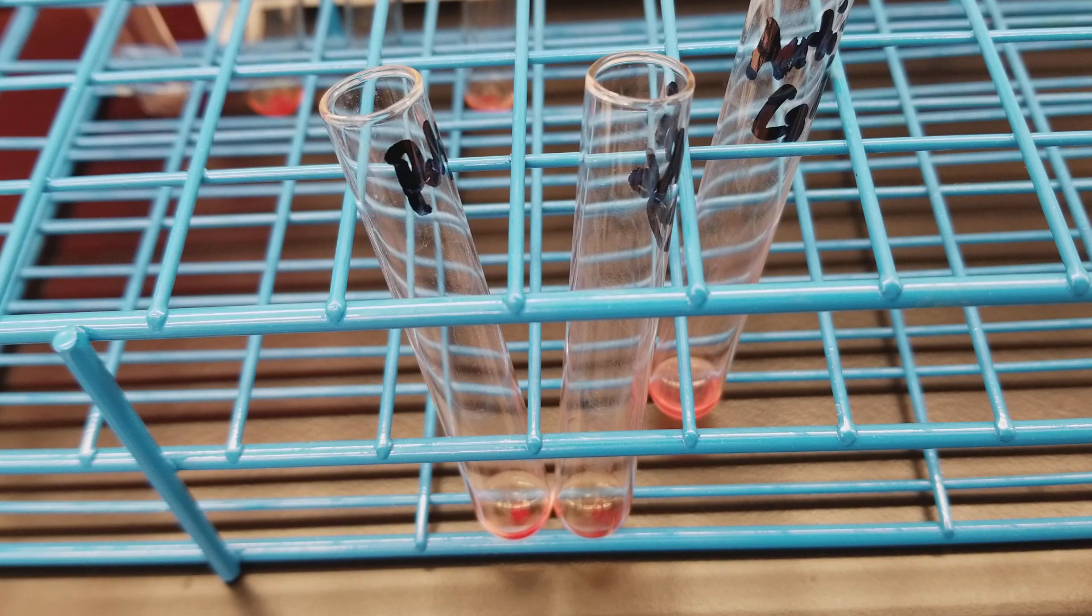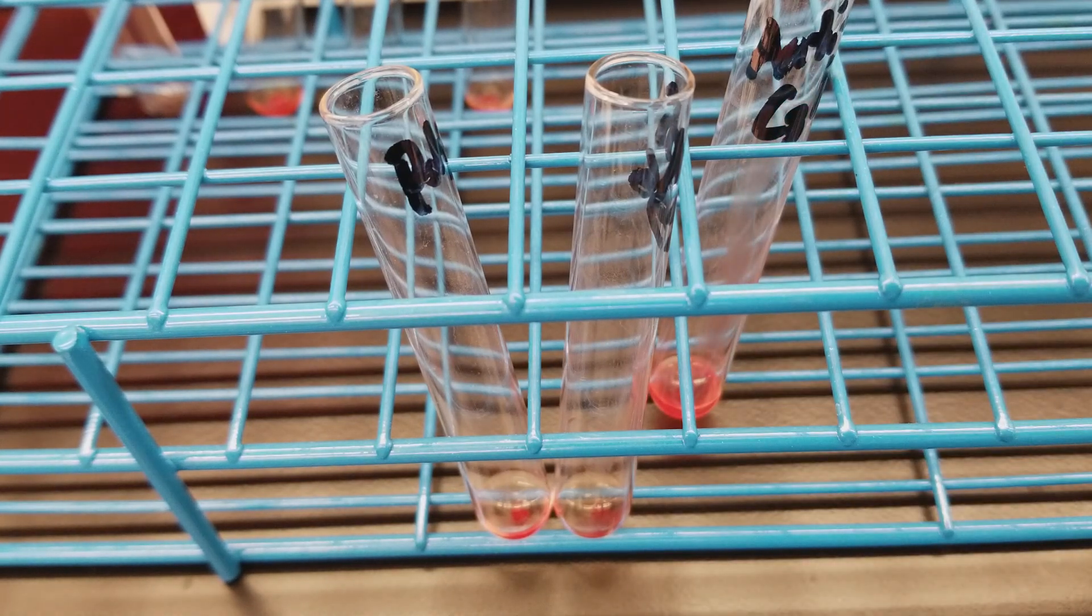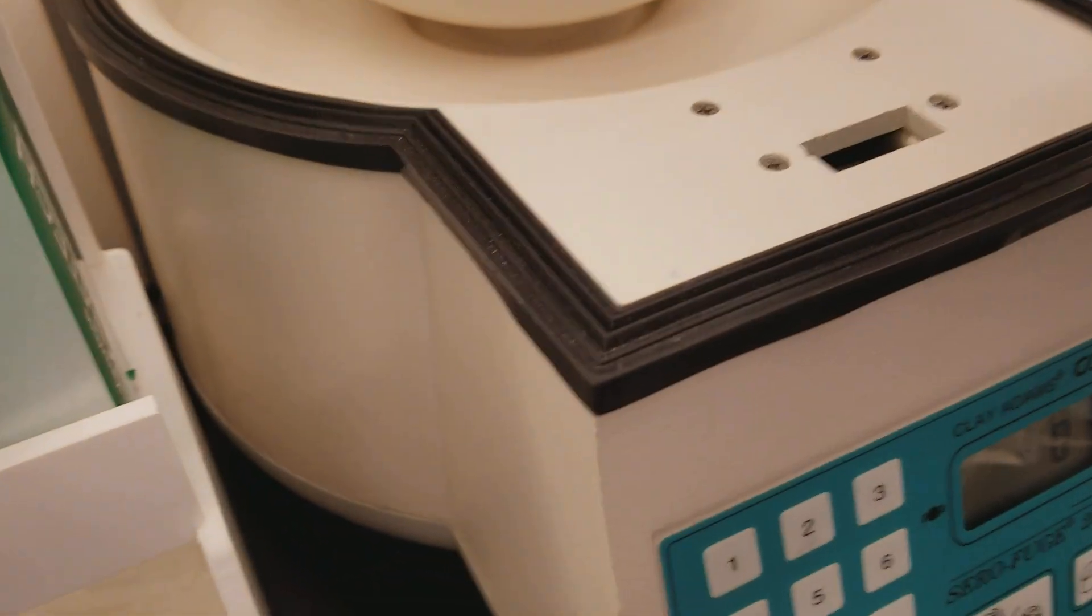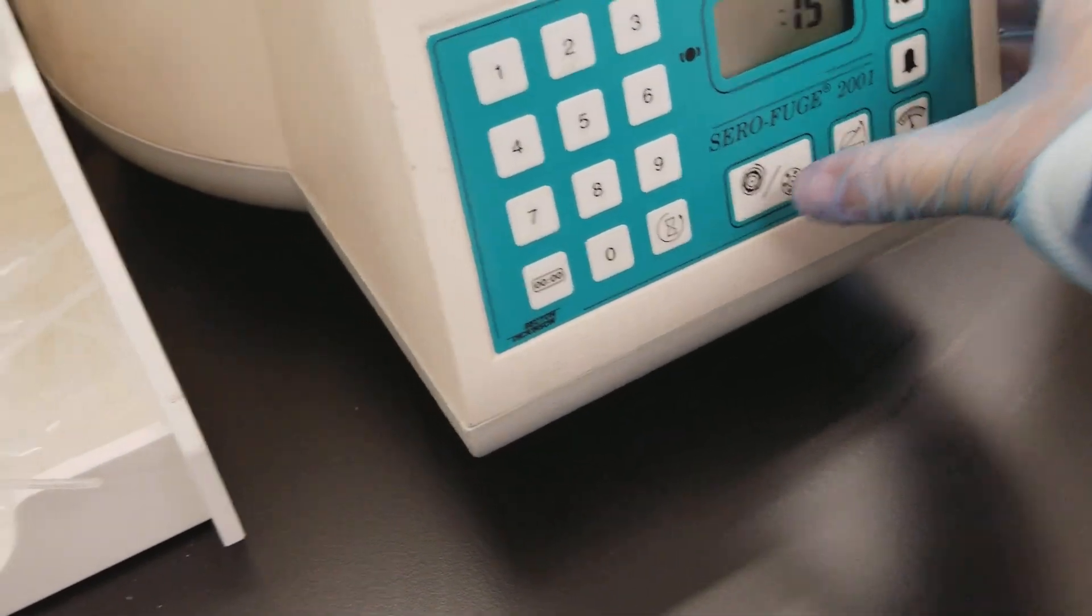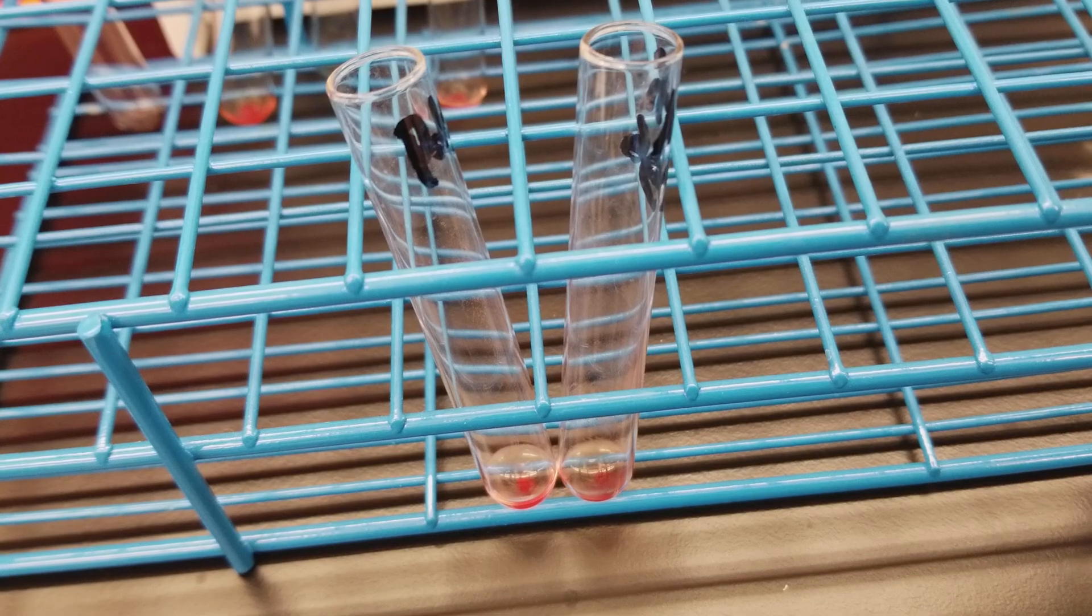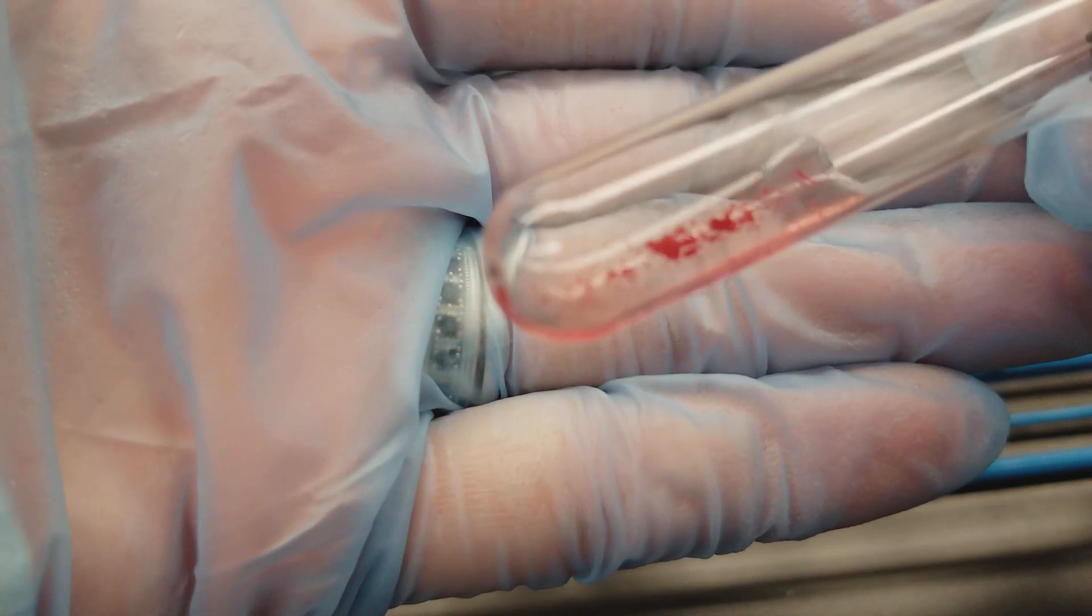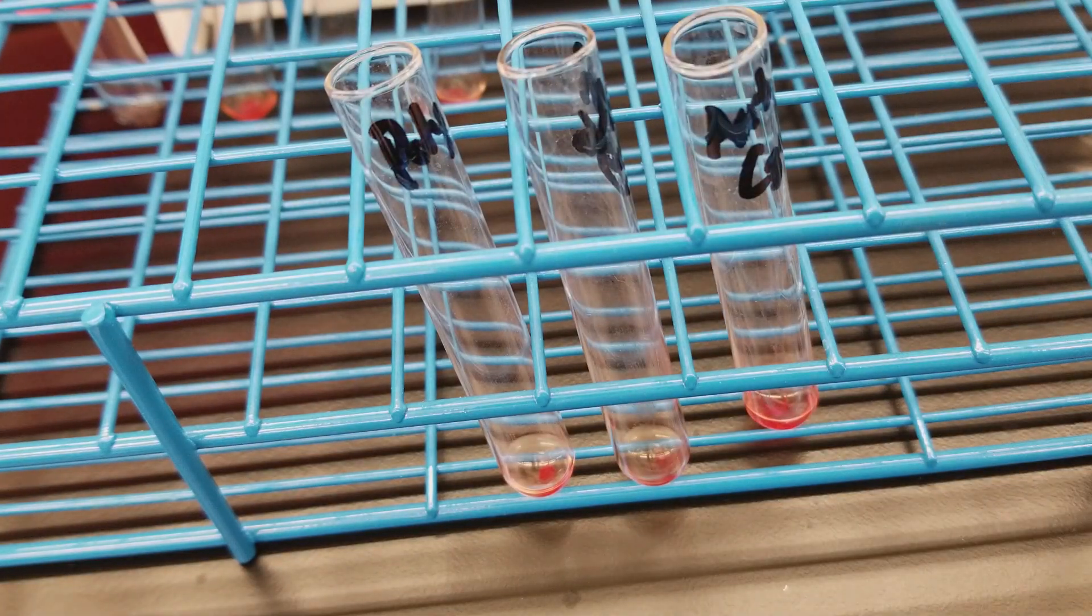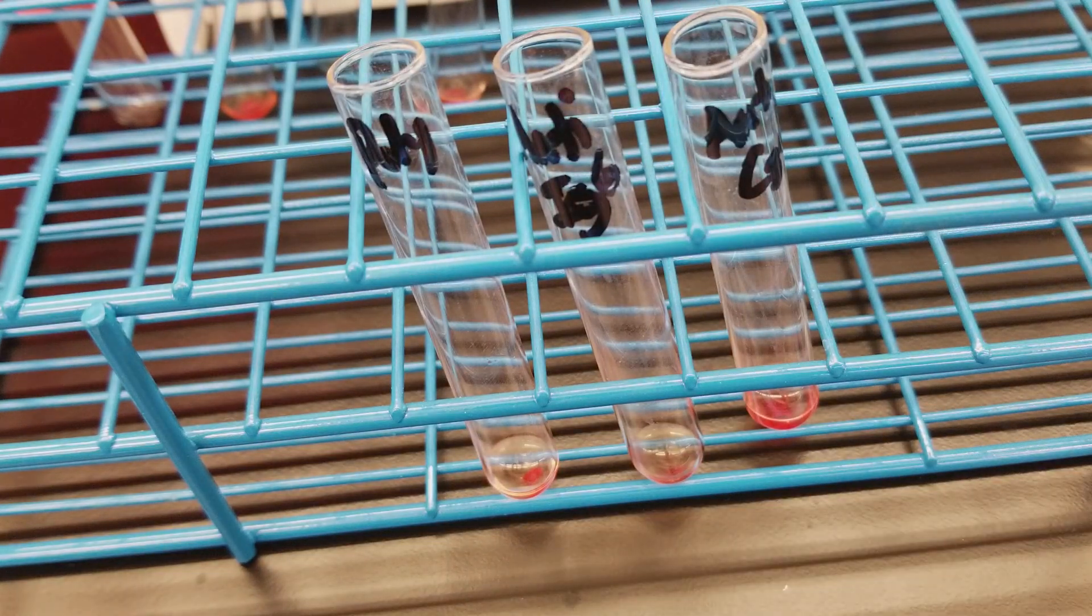I had to resuspend my check cells. So I'm adding check cells to the C3D and then I'm going to spin that and make sure that it goes positive. That is balanced. All right, it's working this time. So I got my C3D out and it is positive with the check cells in it. That means we did everything right and everything is good. So we have an IgG autoantibody on this patient.